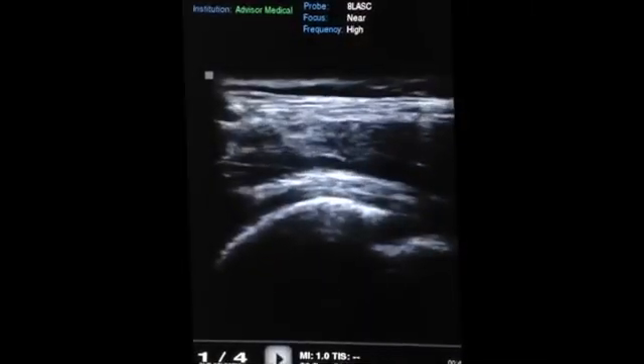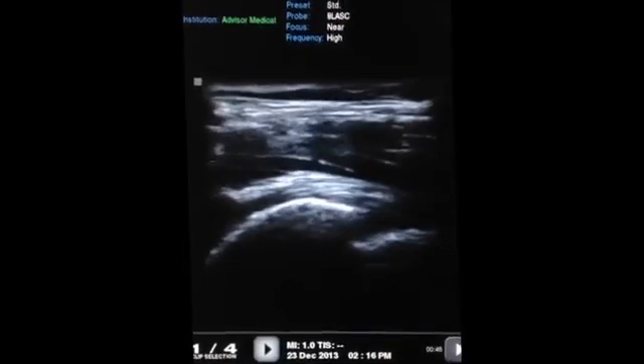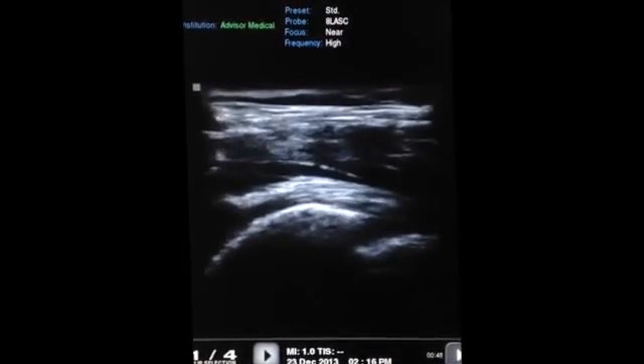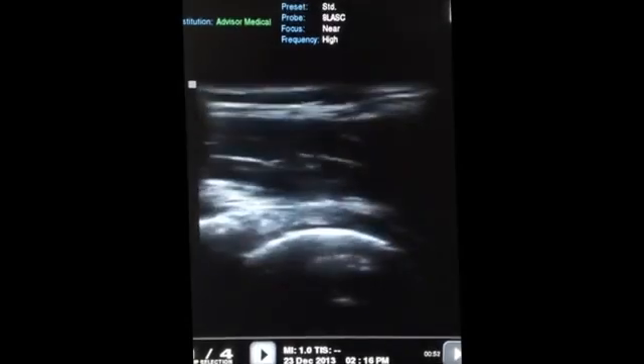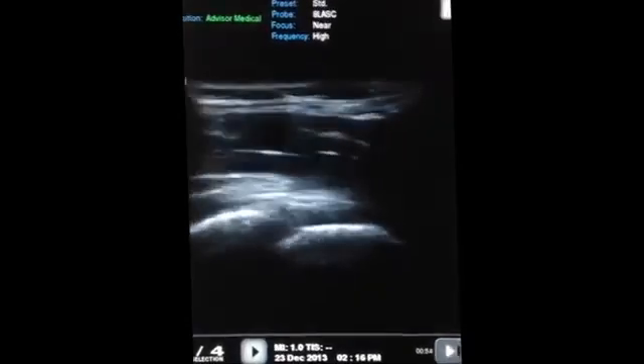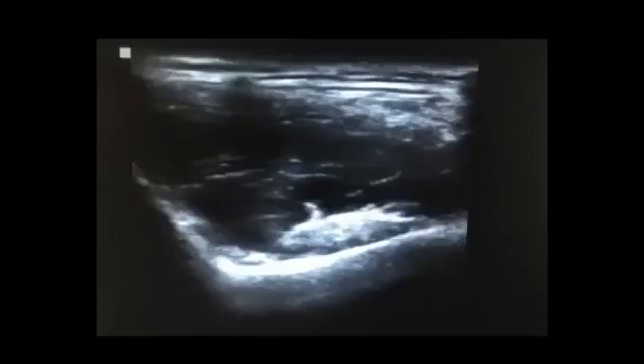If we rotate the transducer 90 degrees, we will be able to appreciate the iliopsoas tendon coming over top of the acetabulum. And you can see that fibrous structure there going over top of the femoral head on the right hand side. Our structure that we're going to inject is the iliopsoas bursa, which surrounds the iliopsoas tendon. As we can see here, the tendon is the structure directly above the bone.